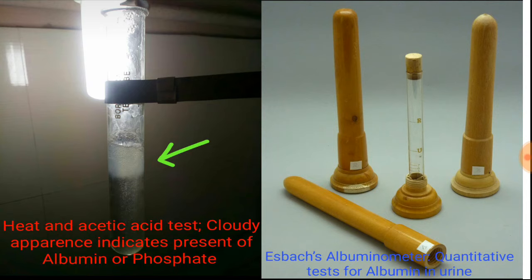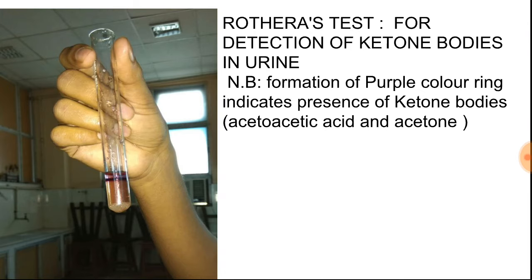Here on the left side is the diagram for the heat and acetic acid test. A cloudy appearance indicates the presence of albumin or phosphate. On the right side is the Esbach albuminometer, the quantitative test for albumin in a urine sample. Here is the diagram for Rothera's test for detection of ketone bodies in urine. Note that the formation of a purple color ring indicates the presence of ketone bodies, that is acetoacetic acid or acetone.